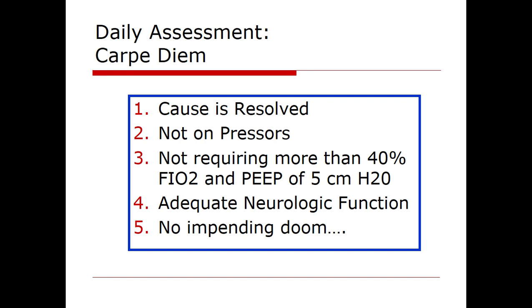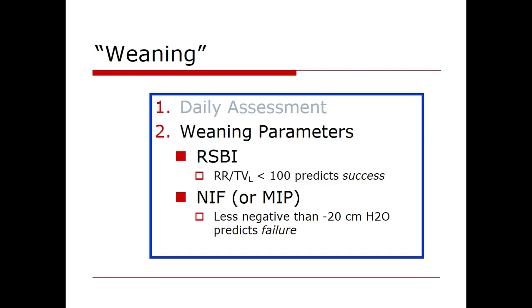You don't have to be reciting Chaucer to be breathing without a ventilator. I mean, look at a couple of people in the room here. And all of us at night when we're sleeping. And just no sense of badness. And so you really ought to ask every day for your patients if they meet these criteria. Then you're going to move on to doing weaning parameters.